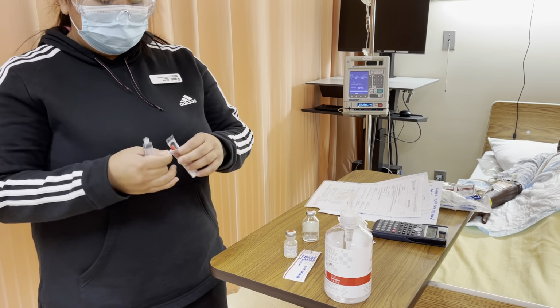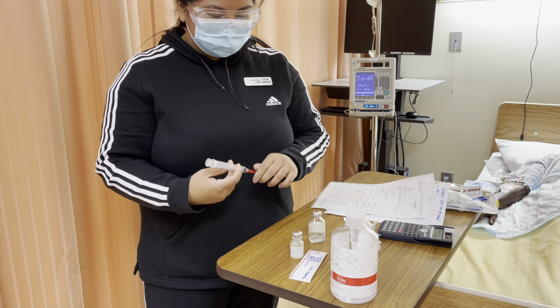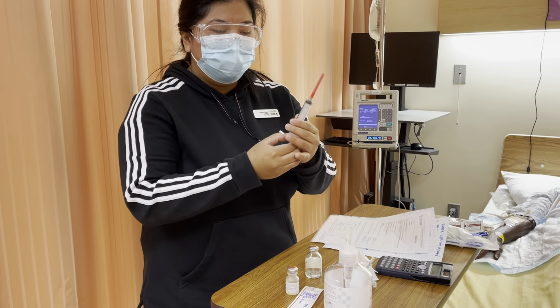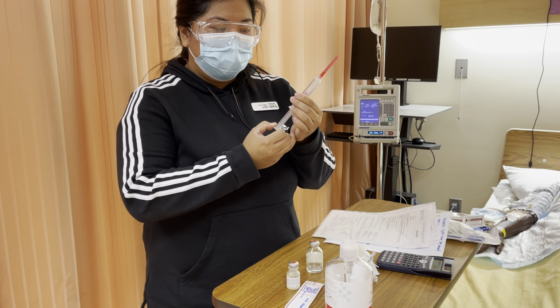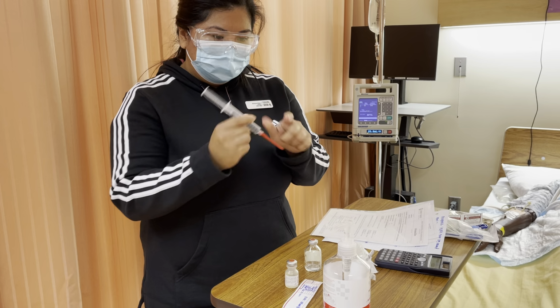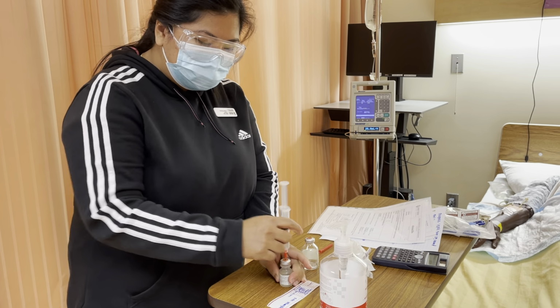And connect that into my blunt fill needle. And then I'm going to draw up 6.8 ml of air into my syringe, and then inject that into our sterile water.